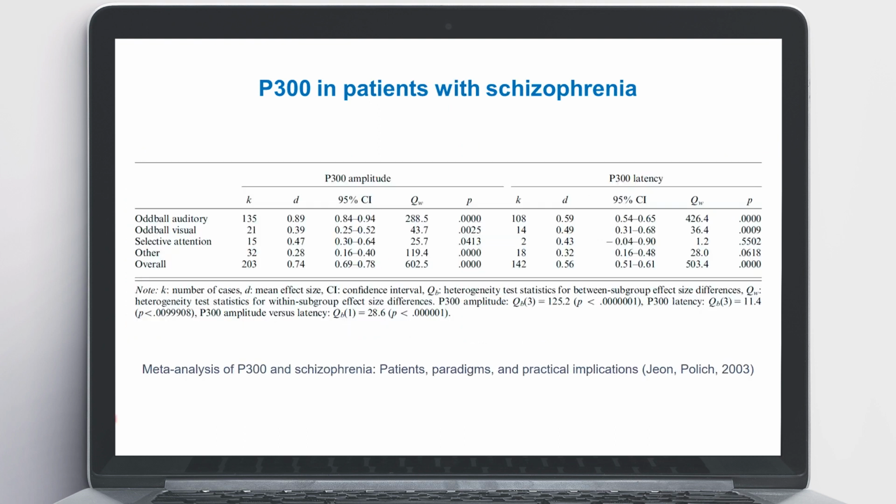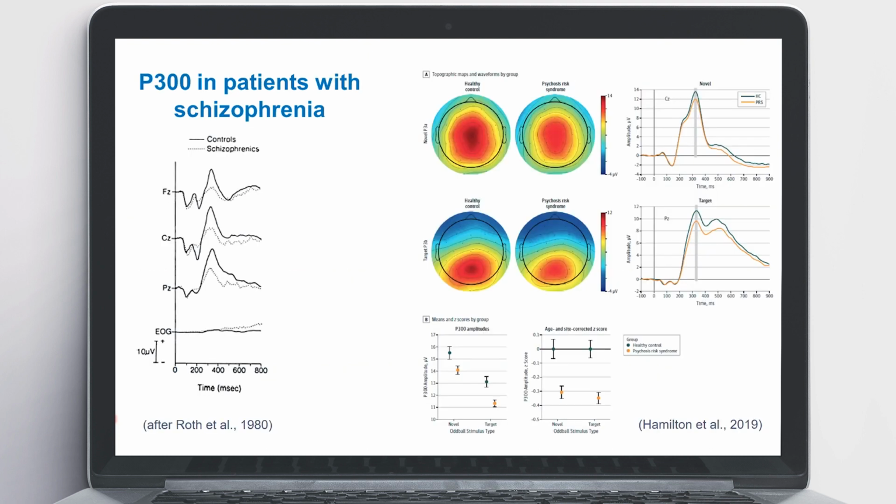When testing patients with schizophrenia, the auditory version of the P300 test is typically used. As in autism, it gives good results. And most of the patients have a reduced amplitude of P300 in this paradigm. P300 is one of the neurophysiological biomarkers associated with the attack-like progressive form of schizophrenia.